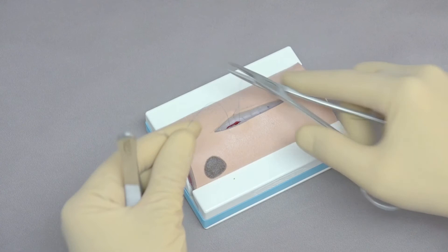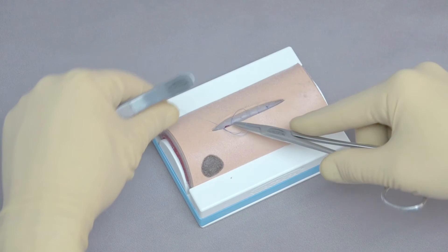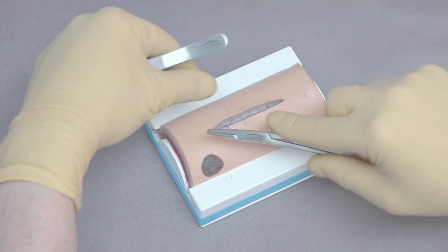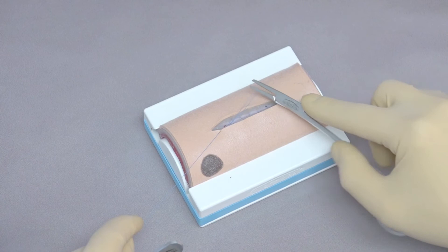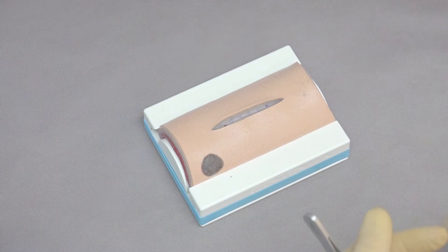Keep just enough suture to tie. Needle holders in the middle, come around once, grab the loop, rotate the loop over, and tighten along the incision line. Back to the middle of the loop, around one time, through, and as you tighten, open the jaws of the needle holder so the loop will equilibrate. Back to the other side, through, tighten, and one more throw — making sure it stays flat, because lifting up makes it a slip knot. Open the jaws of the needle holder so the loop equilibrates. Because this is a buried suture, leave the ends very short — just a couple of millimeters — so you don't leave excess foreign material in the wound.